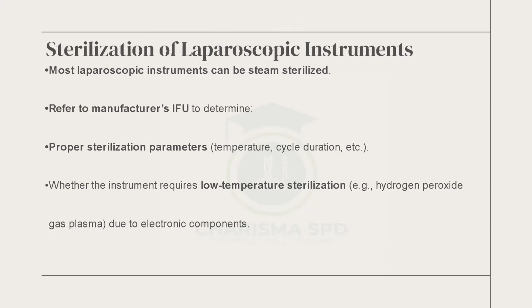Sterilization. Follow the IFU, whether it's low temperature or high temperature. But most of the laparoscopic instrument sets are high temperature sterilization, which is steam. All the same, you get the IFU, and you are not going to be the person inventing or creating the sterilization method. Before you get there, people are already doing the job. They'll just teach you what to do. Just pay attention to what they are teaching you on the job. All right, next slide.